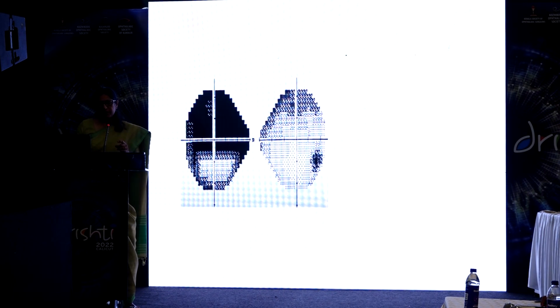So look at this field. It looks like a typical dense field defect in the superior field, almost like an altitudinal defect. But what is surprising is that it has crossed the horizontal meridian. And you can see in the other eye, the fixation has also shifted down. So what is this due to? It is due to some error in the fixation target.